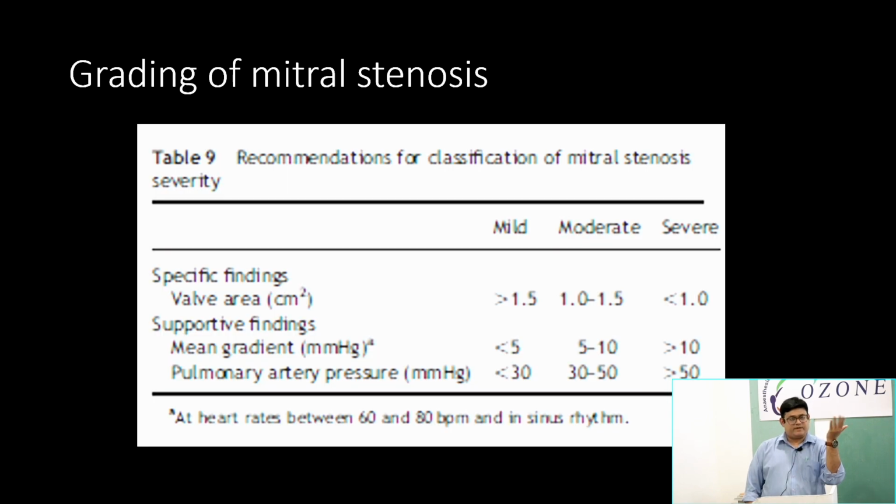So this is the grading of the mitral valve, again available everywhere.